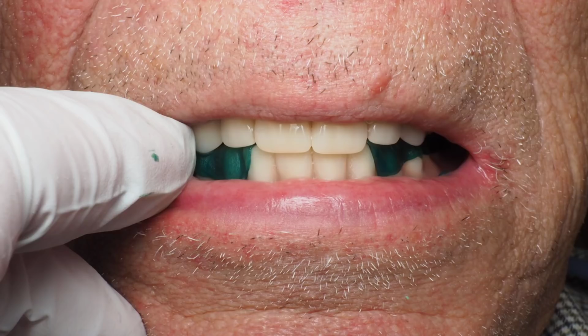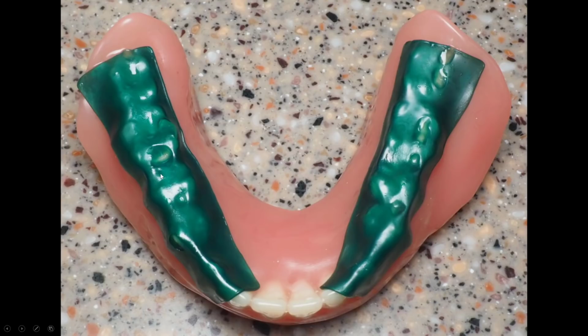You could either do a digital remount, or what I like to do is, in the patient's mouth, use occlusal indicator wax from Kerr, and this allows them to bite into that softened wax and really see the prematurities, but it keeps the tissue pressure even and keeps them from bouncing and sliding off of a prematurity. So I can look at this and see that's a prematurity, that's a prematurity, this and that are prematurities. This is not quite. You can see it's not all the way through. That tiny little bit is. And you can just adjust right through this. It really makes adjusting your dentures much more precise.